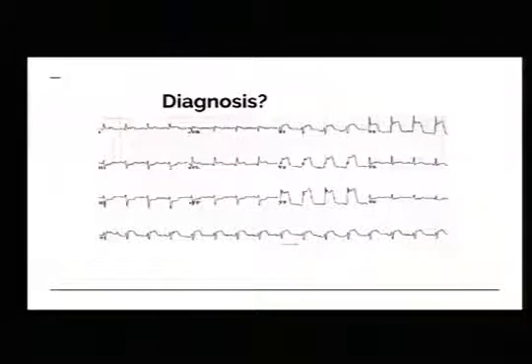What about this one? What region of the heart? Yep, so you've got 2, 3, 4, and look at your inferior. Nice depression over here, reciprocal changes.